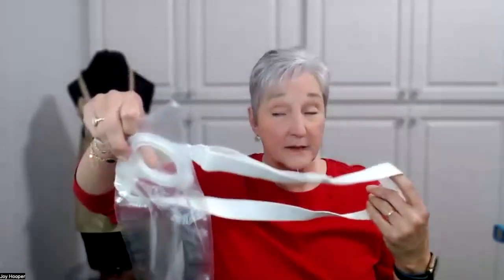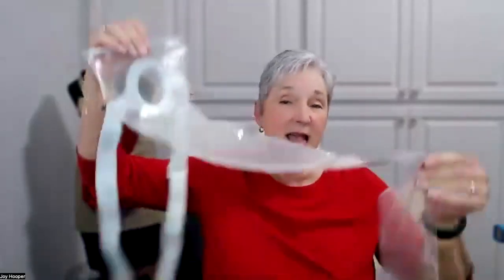This one also has a thumb regulator, and it's got a little wheel that spins around to show you how fast your water's going in. So this is your irrigation bag. And then you'll also wear an irrigation sleeve. And so it goes around your body with a belt. This is actually a two-piece system with the belt, but they do make it in a one-piece system as well.